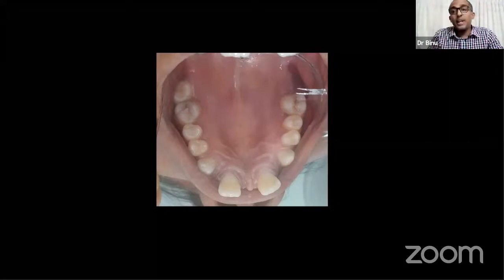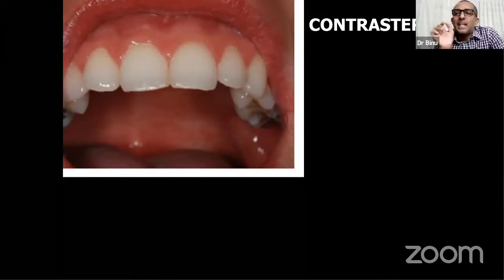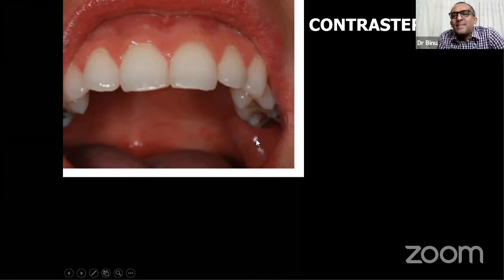But professionally speaking, yes, you are supposed to have a good anti-fog, anti-scratch mirror, a lot of stuff we can talk about, but that is not the purpose of this lecture. Another thing here: this patient, a celebrity, you are trying to explain enameloplasty, mild enamel contouring and all that. Your plan in mind is a canine to canine veneer for beautiful smile creation. You explain everything. After the complete explanation, the patient asks you, Doctor, is this white spot cancer or something?